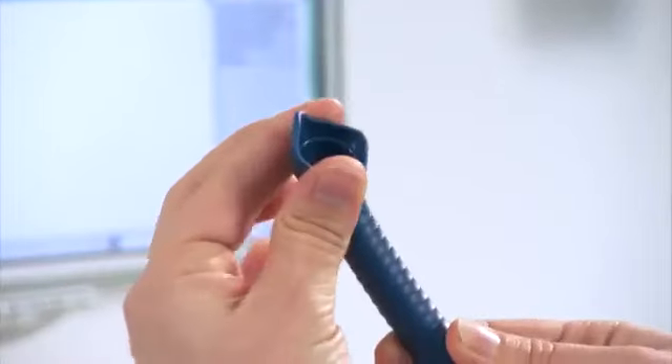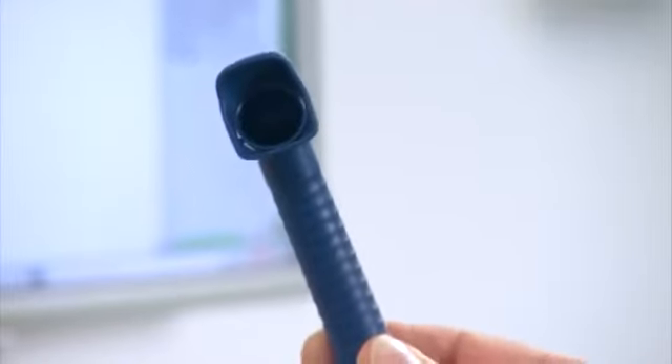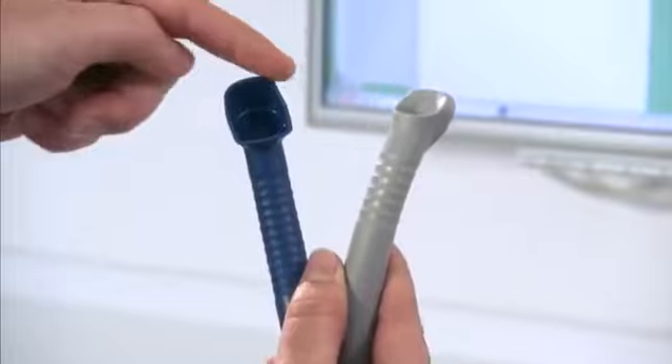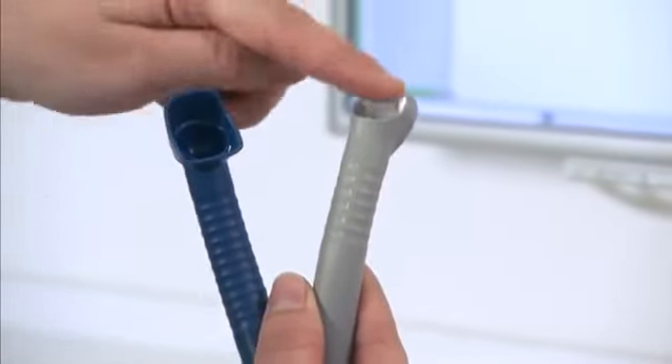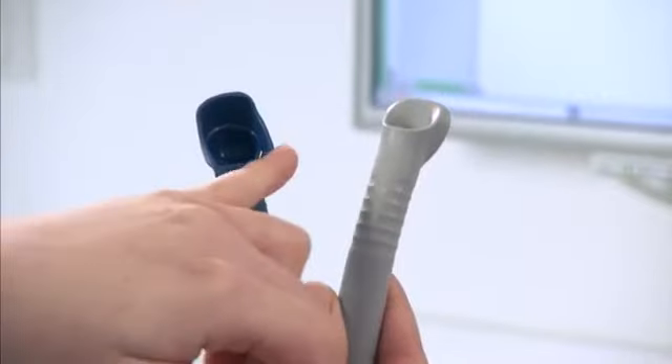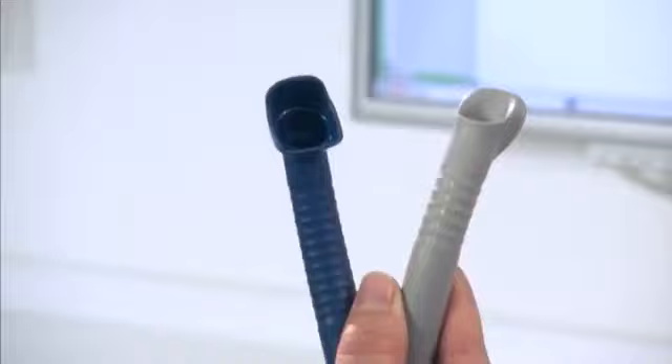The protective shield can be rotated and set as desired. Compared to the universal cannula, the cannula opening is larger. This means that twice the aerosol is aspirated. The ergonomically rounded off cannula opening prevents pressure points in patients' mouths.